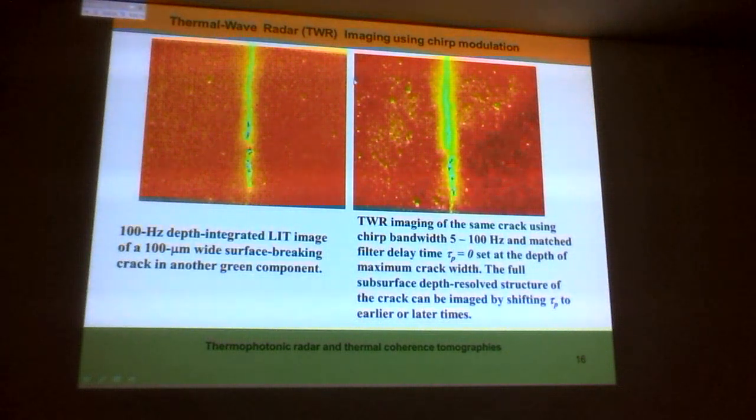because of the coherence. I mean, the camera has to open when the waveform gets to a certain point. Whereas in this case, the camera knows when the wave gets out because you put the wave into the camera. So it is driven by the wave. That's why it's expensive. That's why it's a $60,000 camera as opposed to a $6,000 camera.